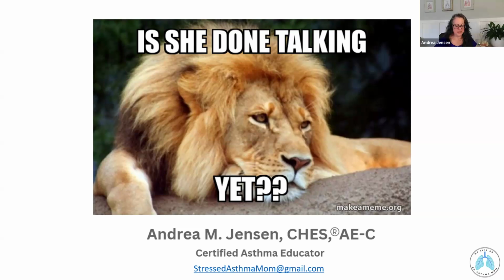You know, Zen, I was just thinking, I have all of my empties, not those kind of empties, like these inhaler empties, spread out on my desk here. And one that I didn't show, I don't think I had a video for this device. So this one, you just put your thumb right there on the ridges, pull it down, and then same thing like the Advair, hold it like a cheeseburger, suck like a milkshake. You've got your mouthpiece there. Remember, with all these dry powder inhalers, to exhale off to the side.